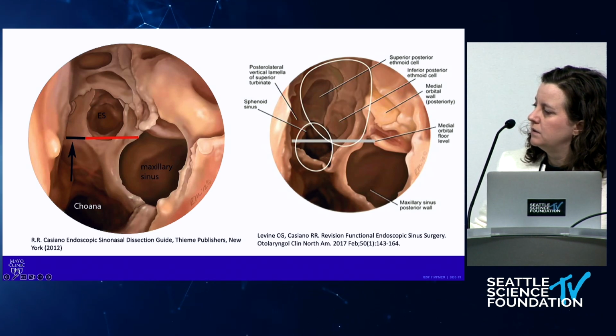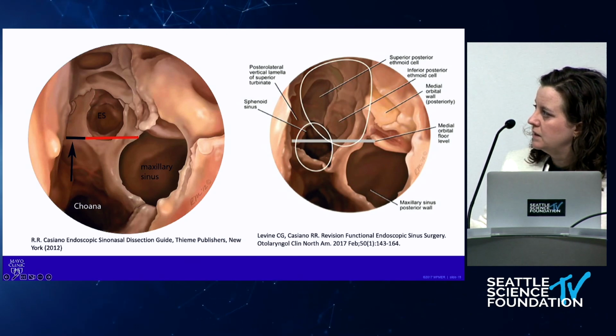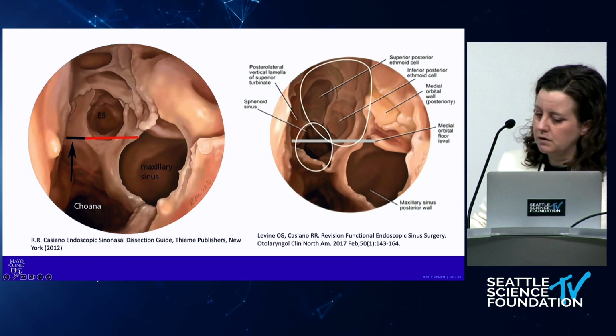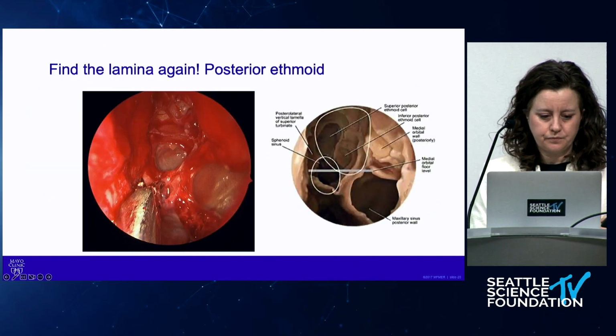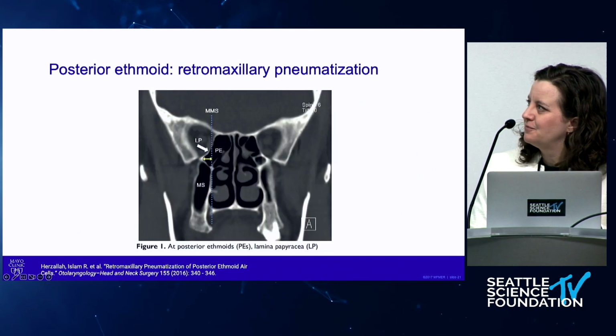You want to open up this basal lamella. It's going to be like a box. That whole box of that horizontal portion, vertical portion rather, is gone. You can extend it down a little bit more. This is again going to be the level of the sphenoid. You're opening up those posterior ethmoid cells to find the lamina, and then you can work on the sphenoid. So like I said, find the lamina again.